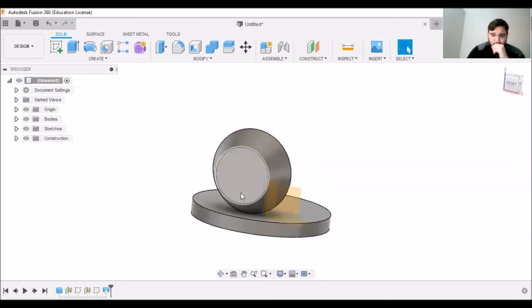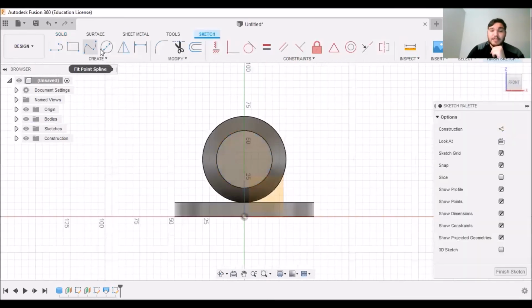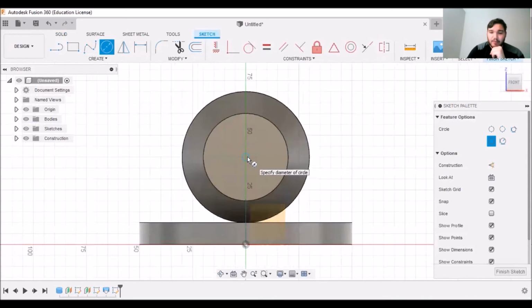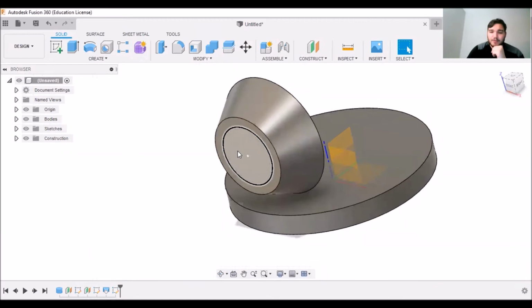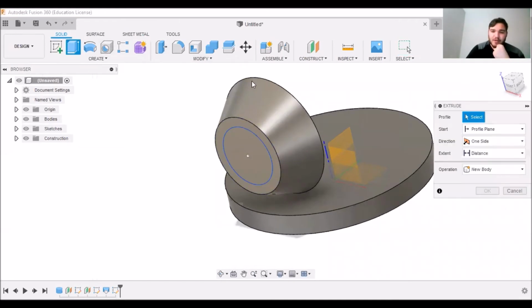And from here, on that smaller circle, we can click on that, create another sketch of an even smaller circle. So same thing, it remembers the center geometry. We can have this one at about 30 of the diameter. Finish sketch. And then now if you hover your mouse over the new geometries that you made, you see that you have the smaller circle and you have the outer ring that you can choose from. We can hit the extrude button up at the top on just the little circle, so not including the outer ring.